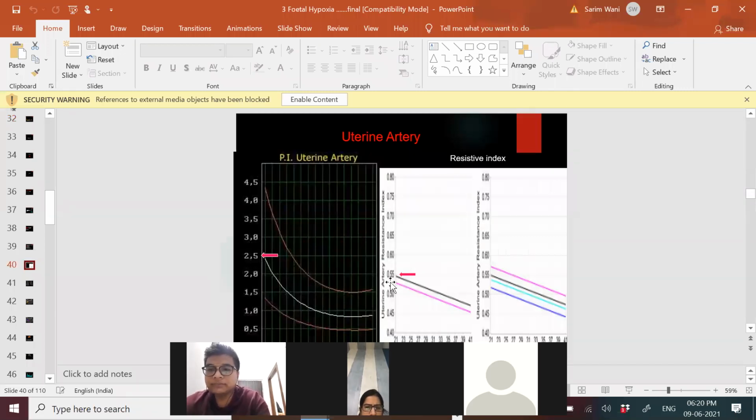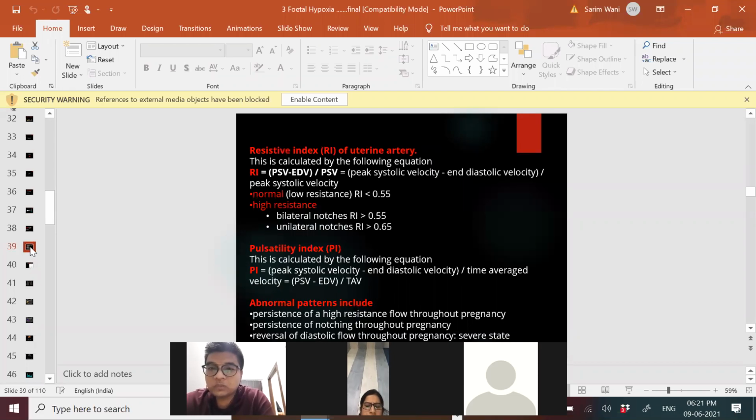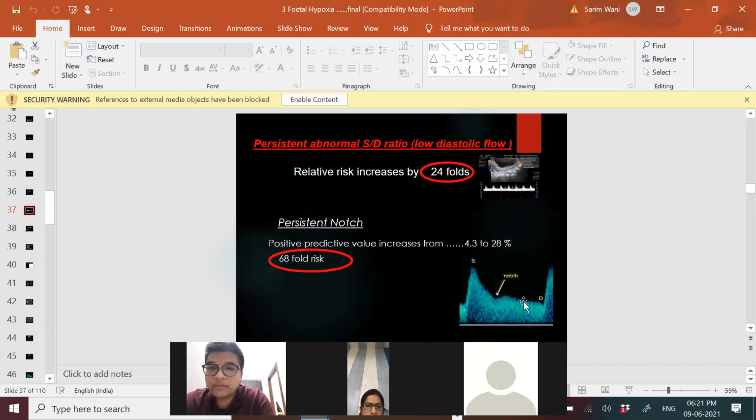A resistive index of 0.55 means that the diastolic flow to this S by D ratio is, for the sake of argument, this much.